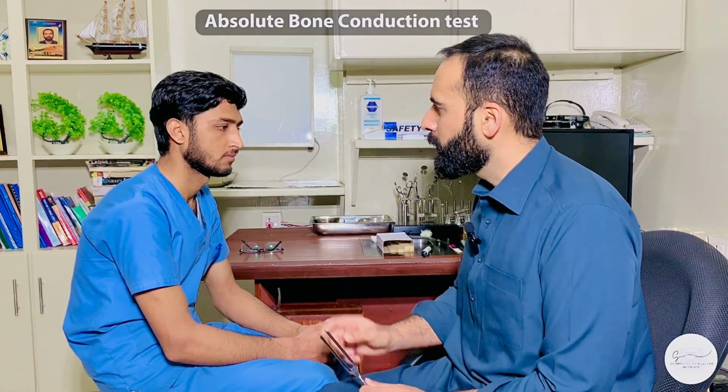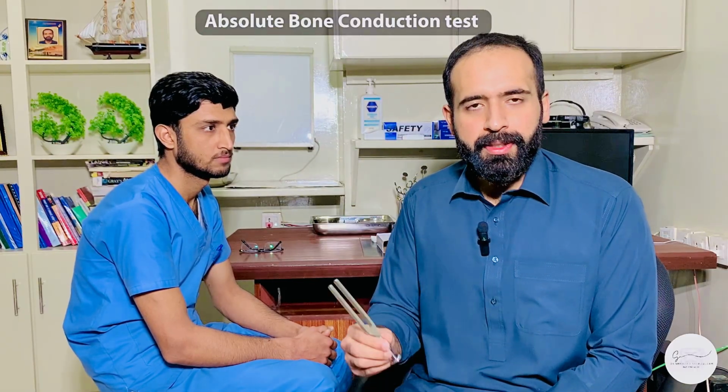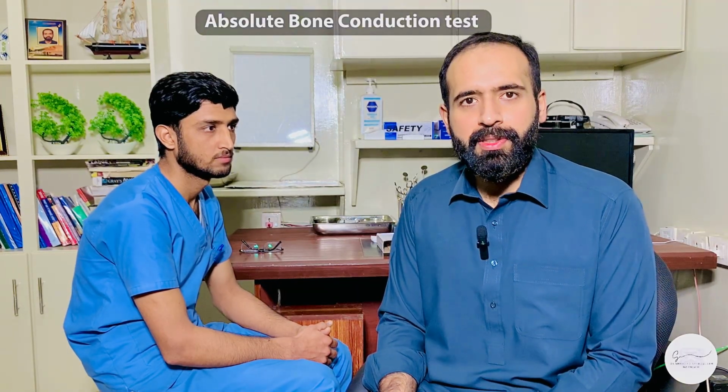So when the patient signals that he is not hearing anymore, you take the same tuning fork and place it on your mastoids. If you can still hear the sound, this confirms that the patient is having sensorineural hearing loss.